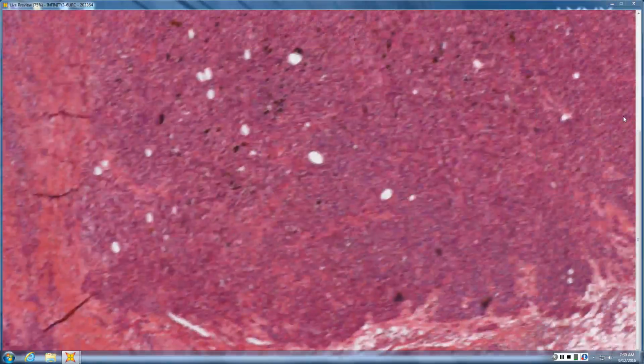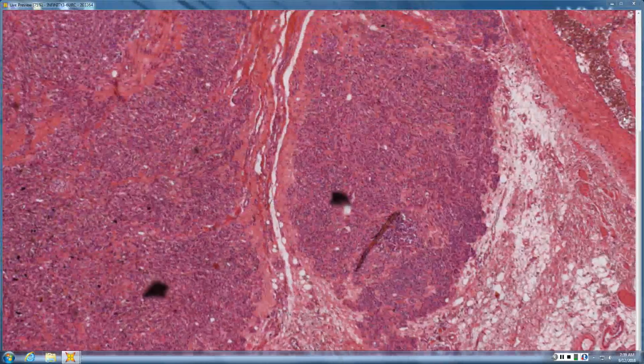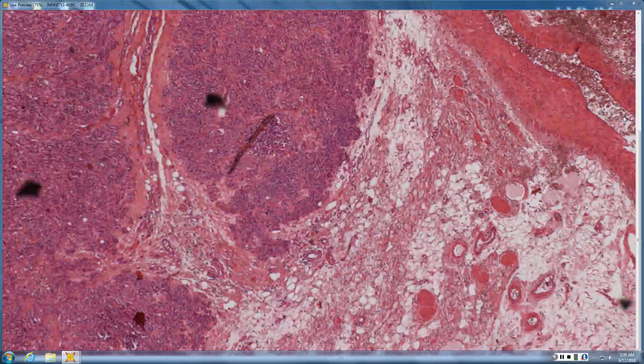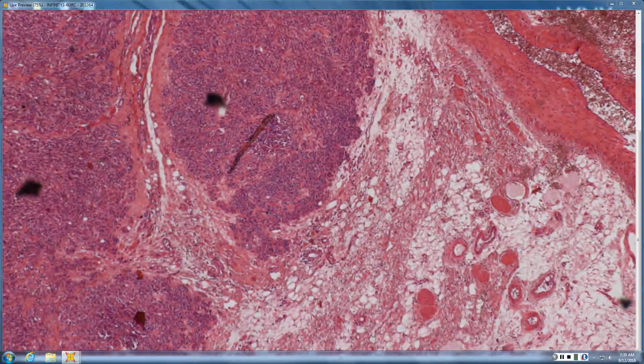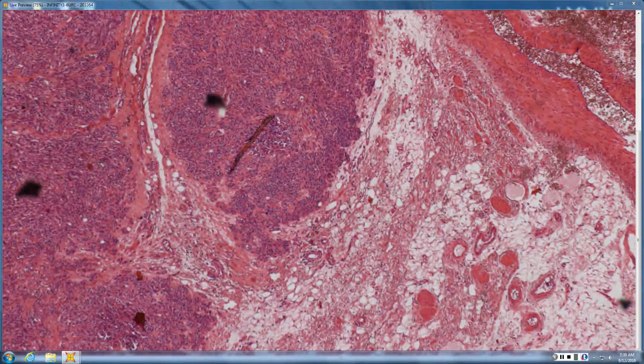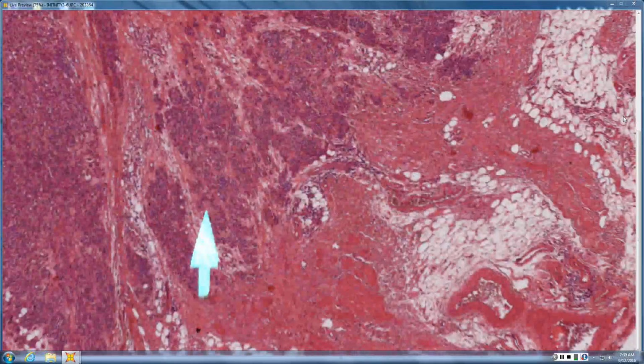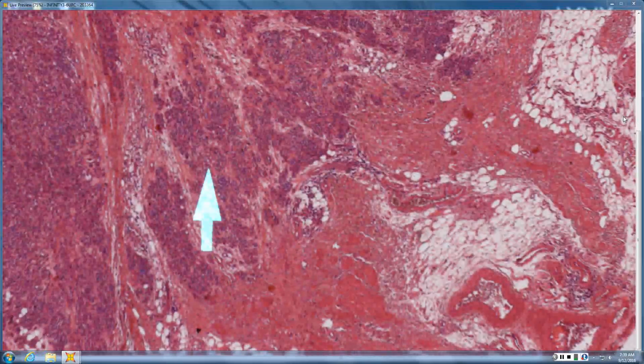So, in contrast to the last one, which matured, dispersed nicely into single file at the base, this remains nested at the base, which is bad in anything except a blue nevus. Blue nevi have a bulbous outline. Looks like Mickey Mouse's finger pushed down into the dermis, right? Big bulbous outline. Doesn't disperse at the base, but that's the difference between melanoma and blue nevus. You will never see a parallel theque pattern in a blue nevus. That's a melanoma pattern when you see that.